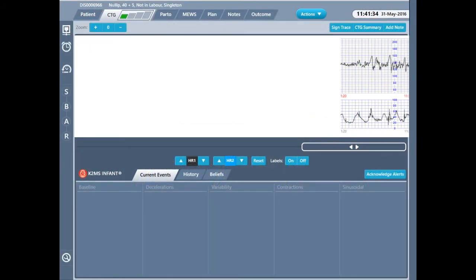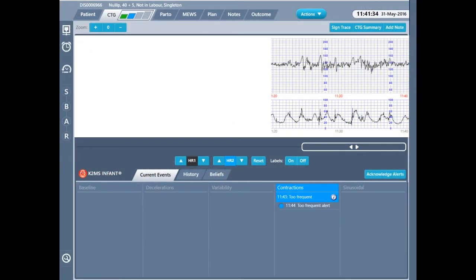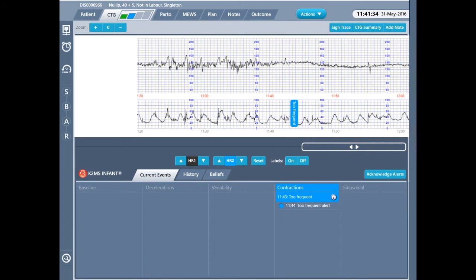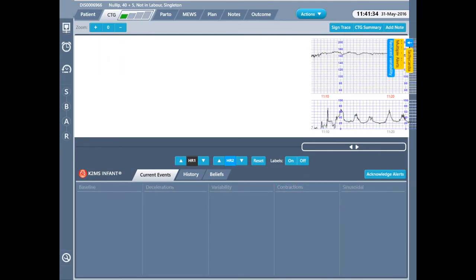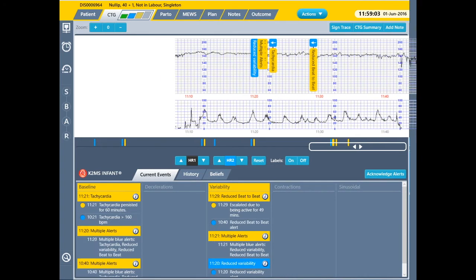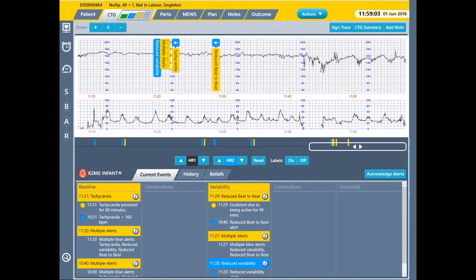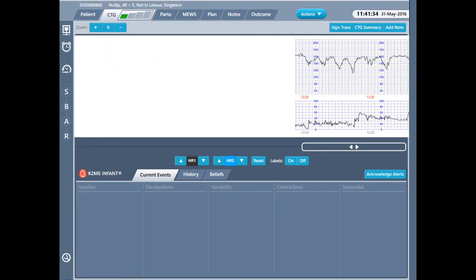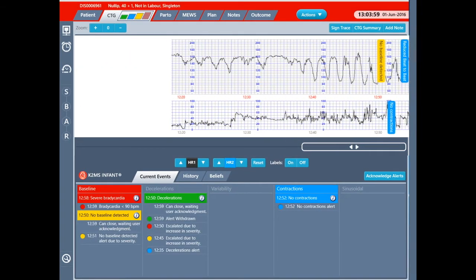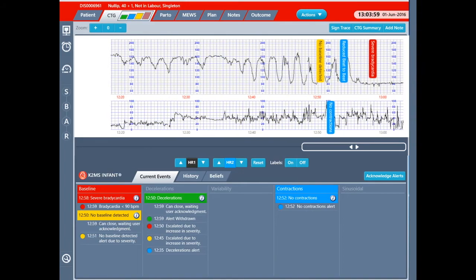Here is an example of INFANT at blue level of concern. INFANT has raised a concern because contractions have become too frequent, probably in response to overstimulation with oxytocins. Here, INFANT is at yellow level of concern — there is reduced beat-to-beat variability and a tachycardia. Finally, an example of red level of concern where we have a severe bradycardia.